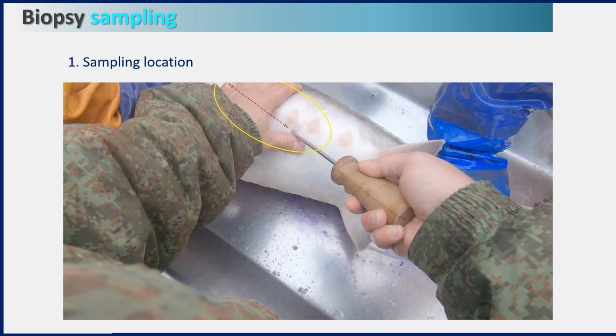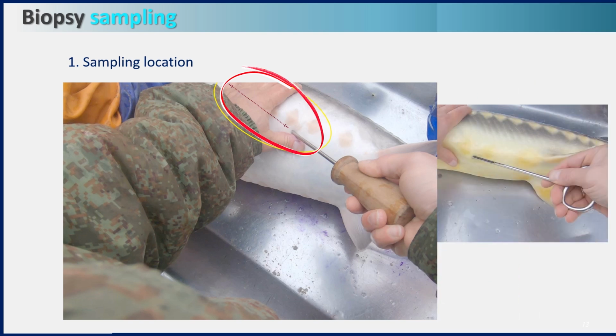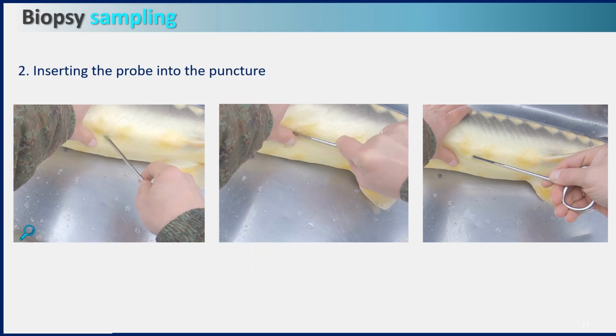Only a sharpened probe can be used for the puncture as well, but we think separating the operations is more correct. To avoid accidentally damaging internal organs, when puncturing, the awl, or probe, is directed parallel to the body line with a slight deviation to the outer side of the fish torso. The probe is inserted into the puncture in a triple motion.